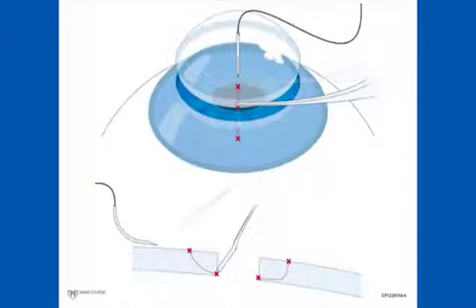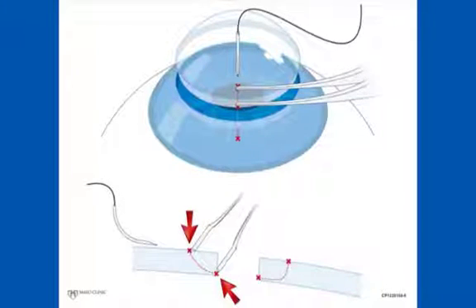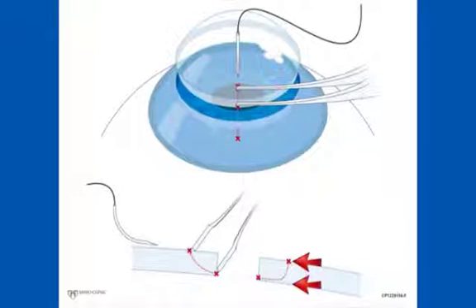Next, the resident gazes at the deep forceps tip to make sure that it stays perfectly still while the top tip moves to engage the surface of the graft. Since one has oriented the forceps tips at a 45 degree angle, the line between the forceps tips is the hypotenuse of an isosceles triangle. The wound edge of most grafts is 800 to 1000 microns, so the distance to the surface forcep tip from the wound margin should also be the same distance, and that distance is the distance from the edge of the graft we want our needle to enter.